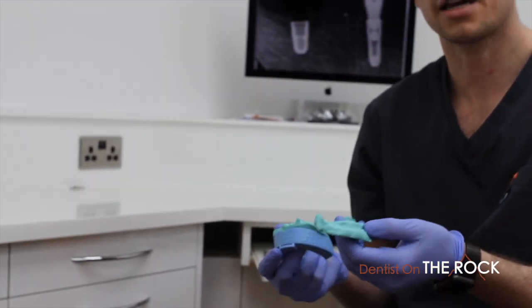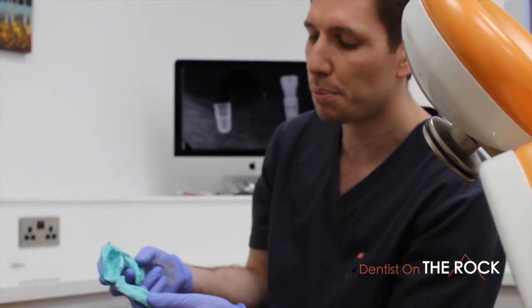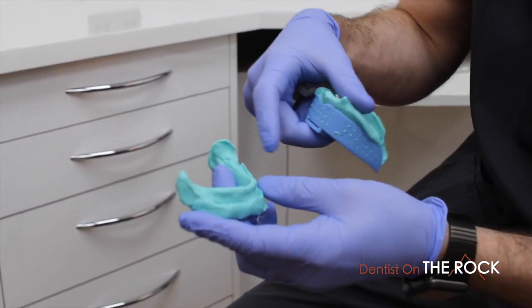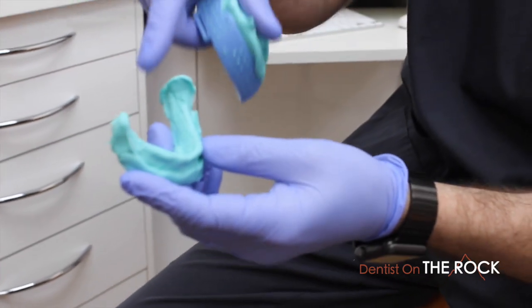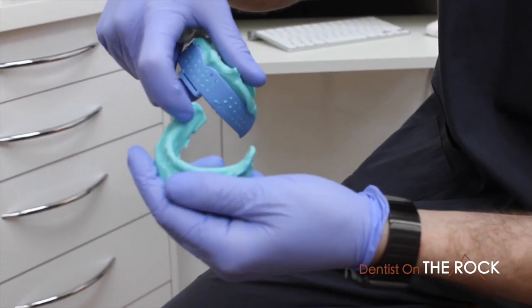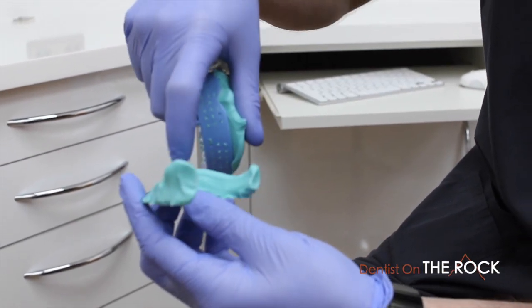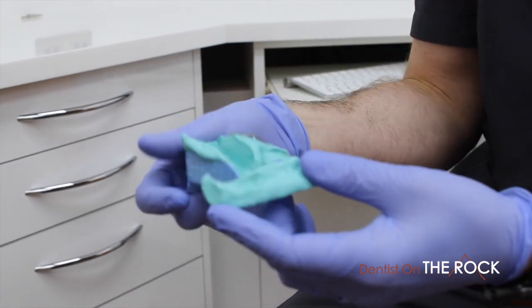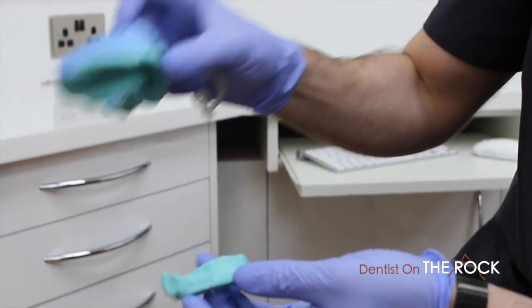It also enables us to do something which ordinarily would have been difficult — taking an object scan. You can take impression scans and model scans, but in this case I've taken a scan of an impression of the inside of the fitting surface of the wax try-in. You can see we've got indentations from the fitting surface in three places.